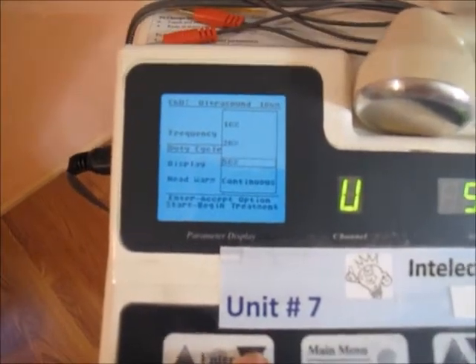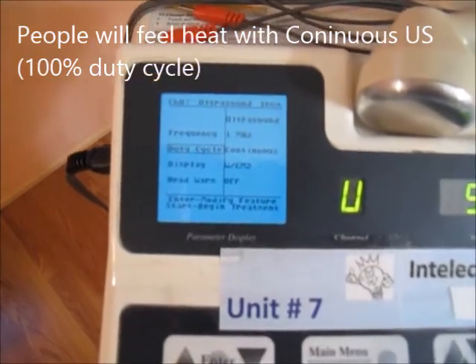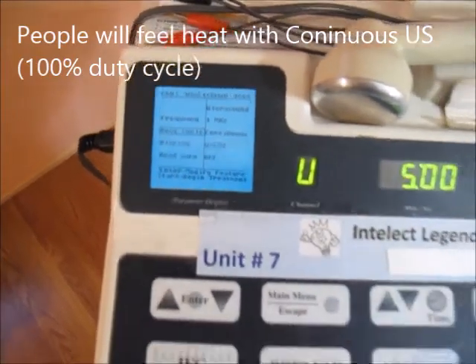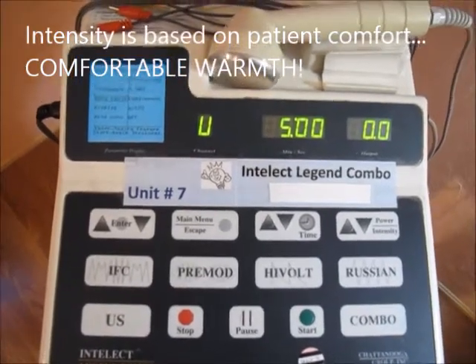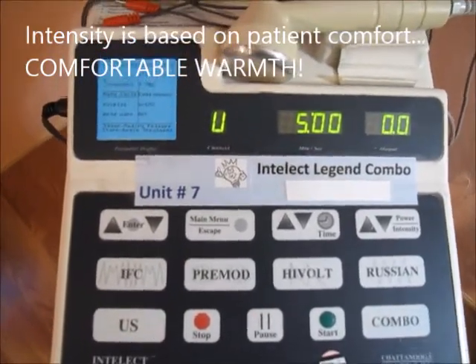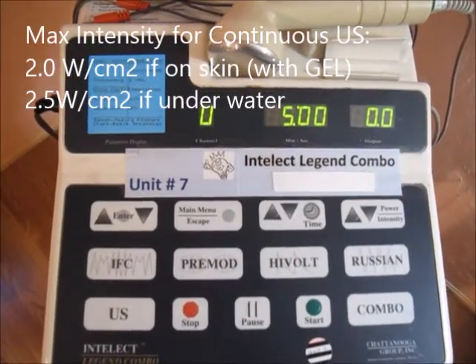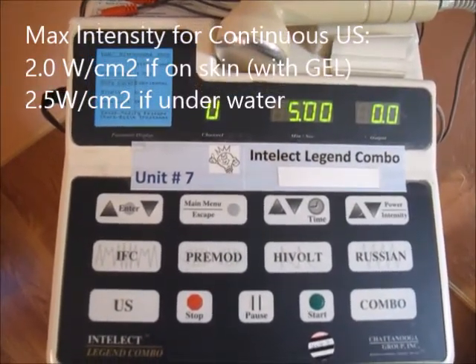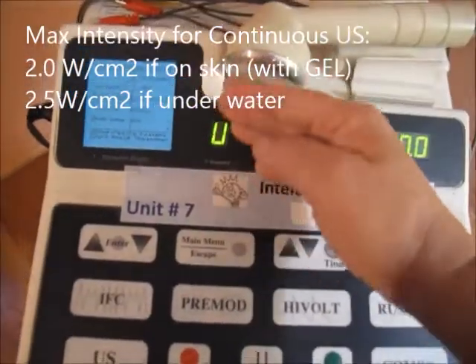So pulsed ultrasound is for healing, and generally people do not feel anything. If you go to 100% continuous, the person will feel heat. The maximum intensity when using continuous ultrasound is no more than 2 to 2.5 watts per centimeter squared. It's 2 watts per centimeter squared if the ultrasound head is directly on the body part.